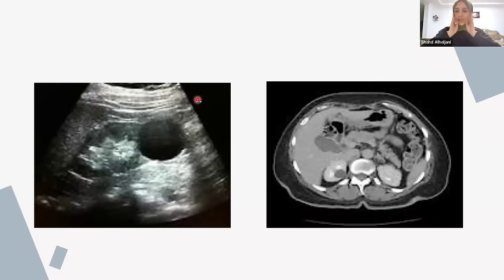Again, for hydronephrosis, you can see it on CT, but you'll first go for an ultrasound, also keeping in mind the patient's condition: is the patient very young, is pregnant, what's going on, and so on. So here in this case, you still see something, but behind it, you don't have a shadow. You have enhancement, it looks brighter, it looks hyperechoic, although the thing itself is anechoic, so it looks dark. So can this be a stone? Is this a stone? Yes, no. Doesn't look like it. Okay, so this is not a stone.